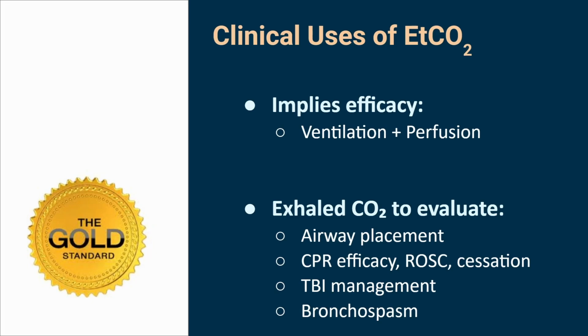meaning that, put pretty simply, if a person never got above 10 millimeters of mercury for longer than 20 minutes, the likelihood they come back is essentially 0. It is statistically not possible. Yet here's the issue with that.